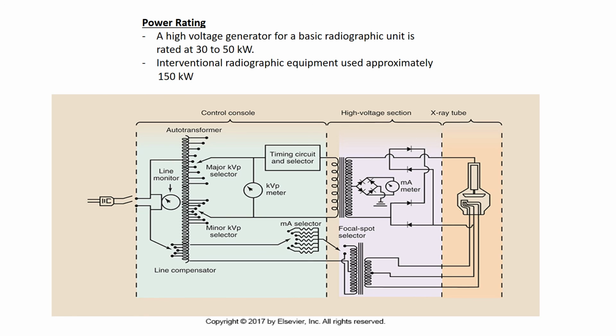I want you to look at this drawing. You need to memorize it. You need to memorize the components of the circuit in order. And then I want you also to look at Carlton, look at that drawing. And once again, you're going to see it's drawn a little bit differently, but everything is in the same order.